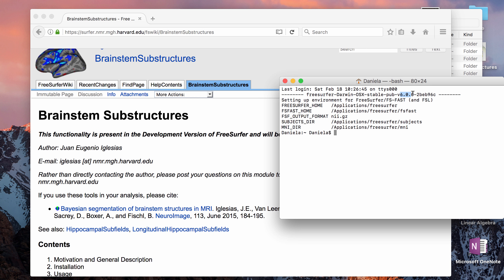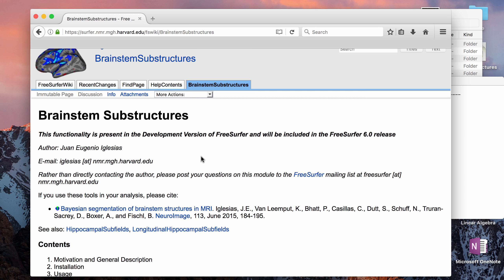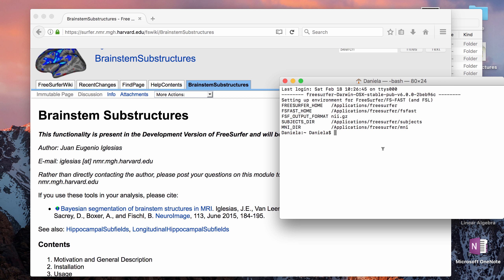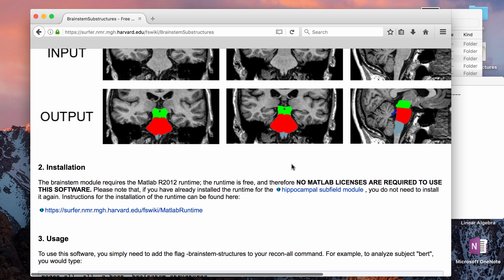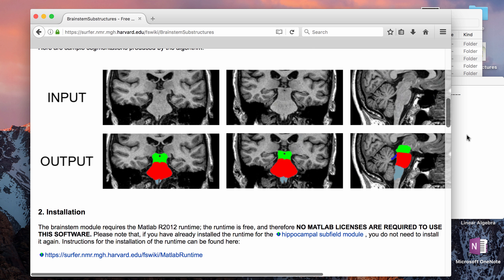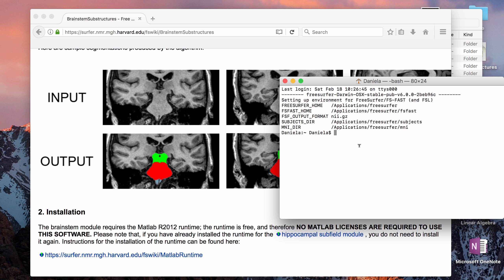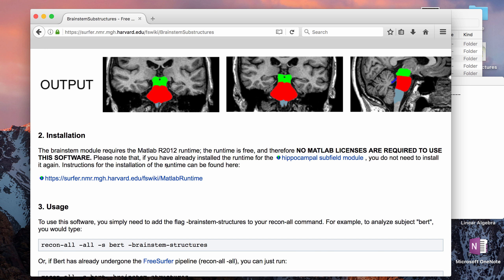I already have 6.0 downloaded. If you guys were using 5.3 before and you upgrade to 6.0, you're also going to have to download a Matlab runtime from 2012, and also when I tried to run it I had to download a specific version of Java as well. The nice thing about FreeSurfer 6.0 is if you don't have those downloaded on your computer, it will tell you the lines of code directly on the terminal for how to download the Matlab runtime and also how to download Java. It mentions it here as well in the tutorial.